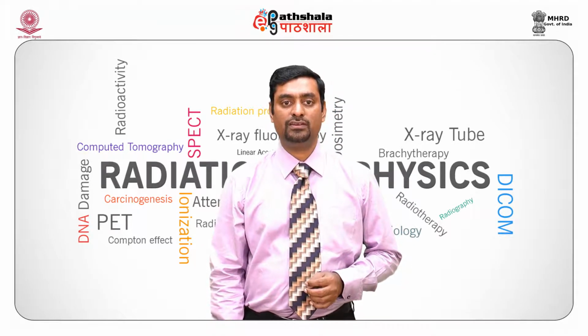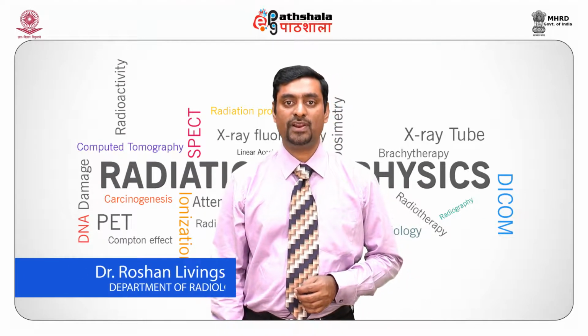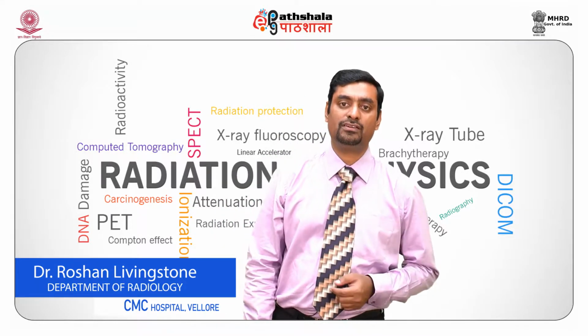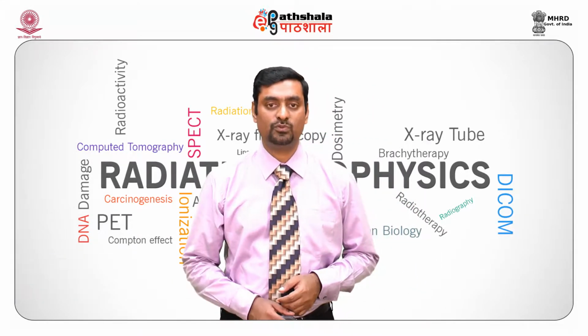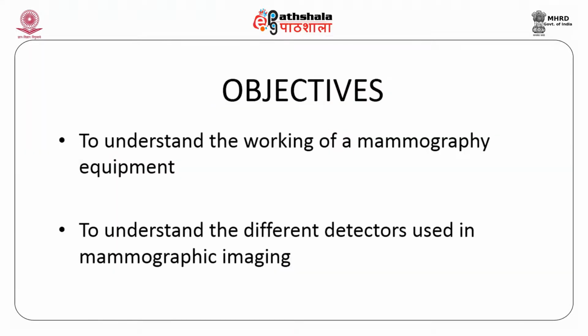However, it is also required to keep radiation doses as low as possible because the breast is a radiation sensitive organ and there is a risk of carcinogenesis associated with the X-ray technique. So what is the basic objective of the study? To understand the working principle of a mammographic equipment, and to understand different detectors used in mammographic imaging.